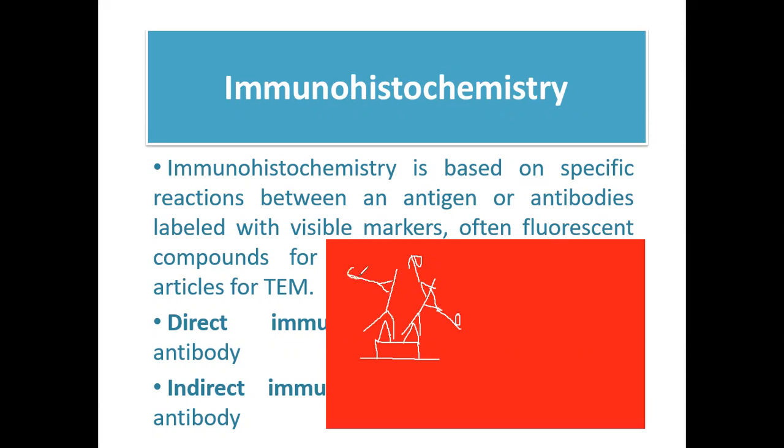So, labeled yan. Secondary antibodies lahat to, yung kumabit dun sa mga primary antibodies natin. Okay? So, guys, napansin niyo dun sa mga primary antibodies natin, madaming pwedeng kumabit na secondary antibodies. This is your indirect. Ibig sabihin, guys, look at that. It's very sensitive. Okay? That even in a small amount of antigen, kaya niyang i-amplify yung result mo. Positive result. Kasi madaming primary antibody ang pwedeng mag-amplify ng result.